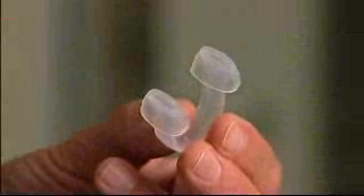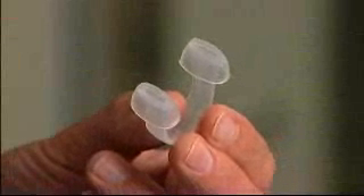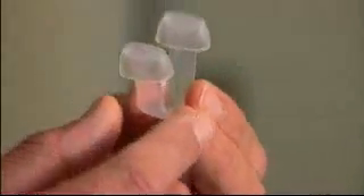It is recommended you use the nasal plugs for the first few weeks of therapy. This will encourage you to breathe exclusively in and out your mouth. These come in three sizes: small, medium and large. Insert into the nose ensuring the base of the plugs are just inside the nostrils. The plug should fit comfortably inside the nose and should seal off any flow of air. If not, try the other sizes.